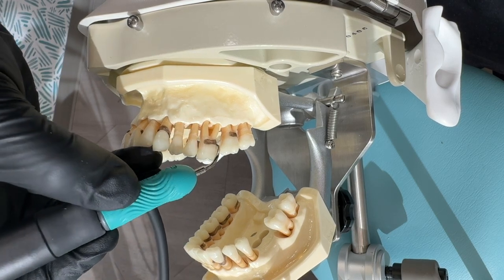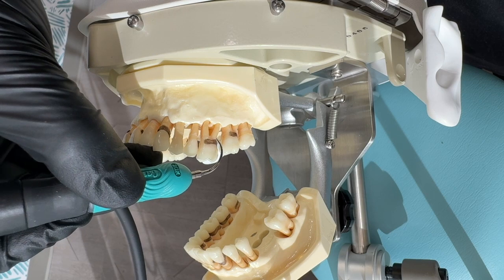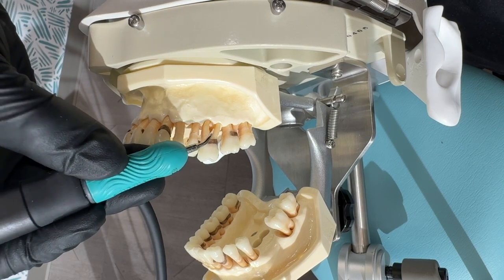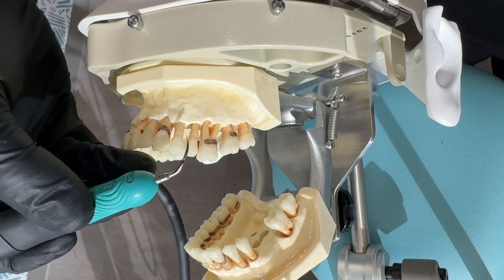The tricky thing — and remember, this is under the gum, so it's a lot tighter usually — as we come along and we're coming, wrapping around, this tip sometimes gets on that cementum that's maybe soft, and we can remove some cementum, unfortunately, which is not the goal. So it's really good, instead of using your left in this buccal, to switch it to the right.